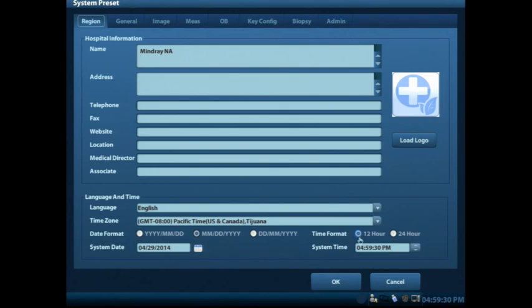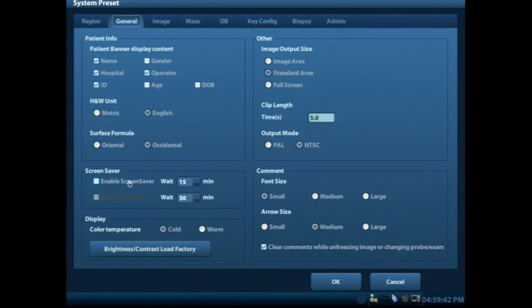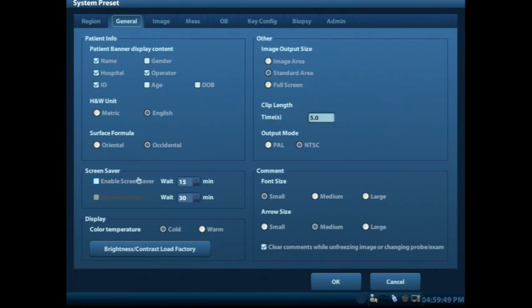You'll see that you have a 12-hour format as well as a 24-hour format. Other tabs in this System Preset allow you to select the patient information that's applicable on the screen. And then we also have the ability to have a screen saver and our standby mode. Those will be default selected, so you'll see that they are checked when you look at your machine.